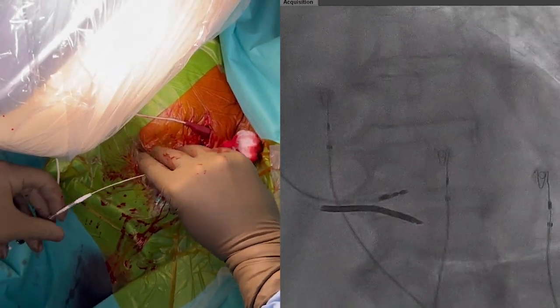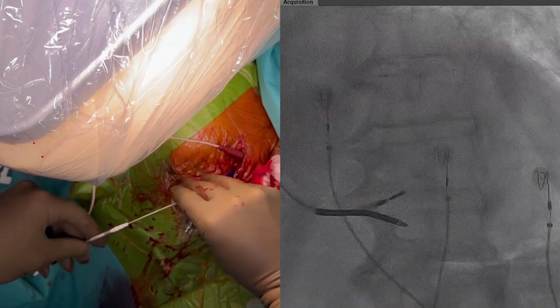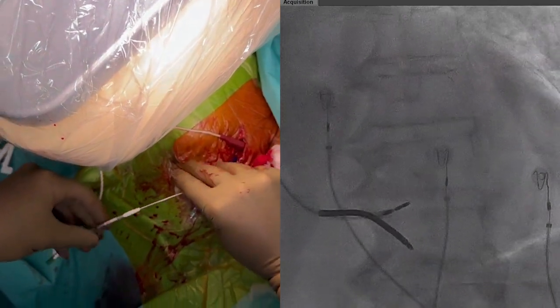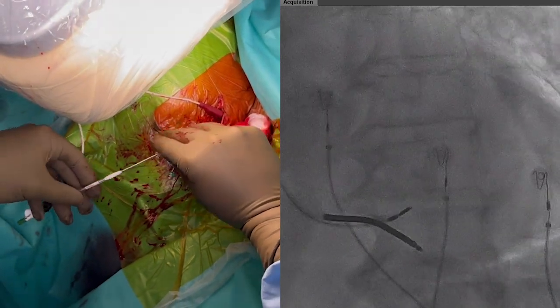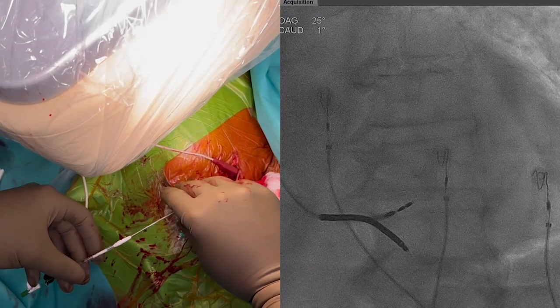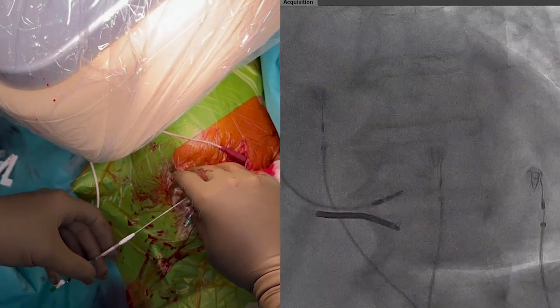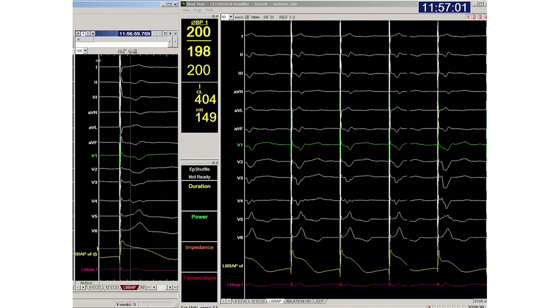While progressing through the septum, we need to make sure that the green stylet tool remains fixed and the stylet stable. On fluoroscopy we can see the lead advancing through the interventricular septum. Impedance values may be monitored to guide this process, as a declining trend signifies reaching the LV endocardial zone.